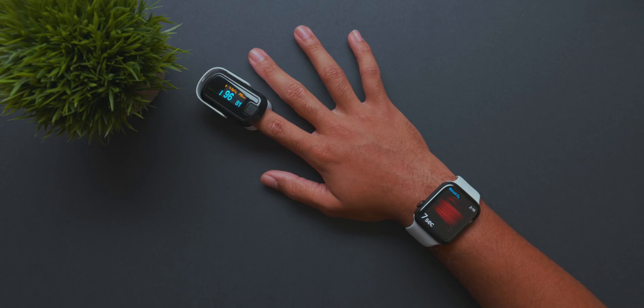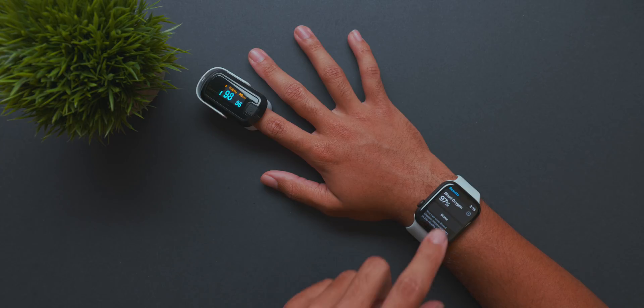Since the pulse oximeter was doctor recommended, I'm going to say that the Apple Watch should absolutely be trusted in regards to the blood oxygen level test. Now, there's always going to be someone in the comment section that says this isn't accurate and it shouldn't be trusted. I respect those comments, but I just want to point out that this pulse oximeter was doctor recommended and the results are pretty much spot on with the Apple Watch.